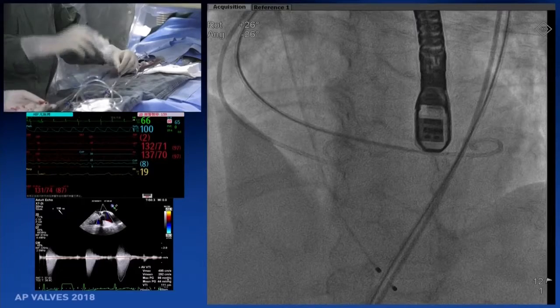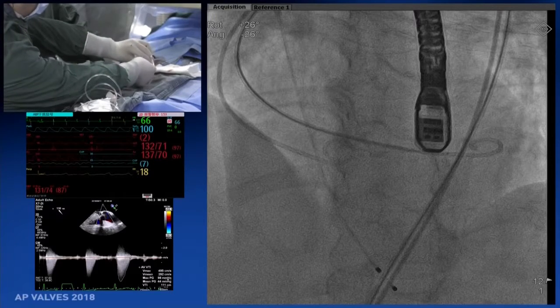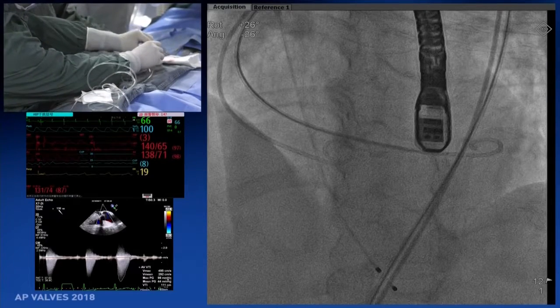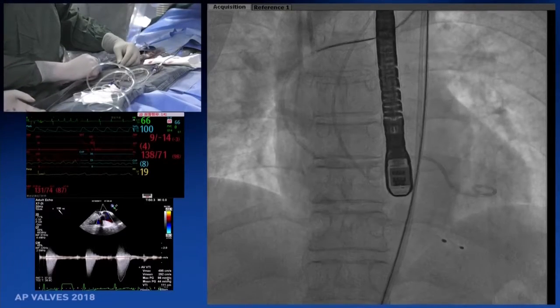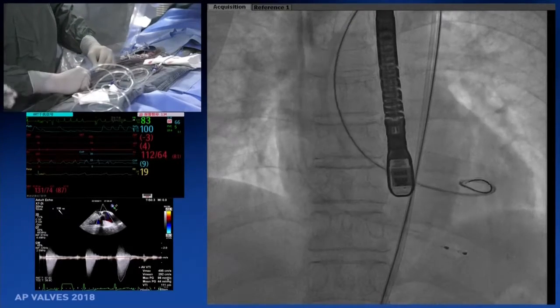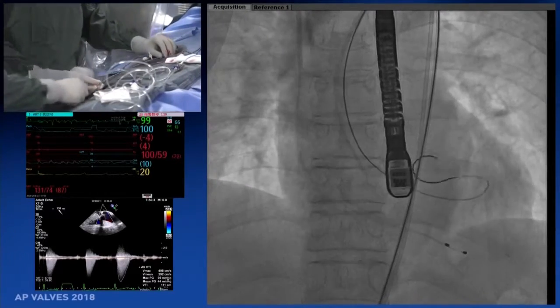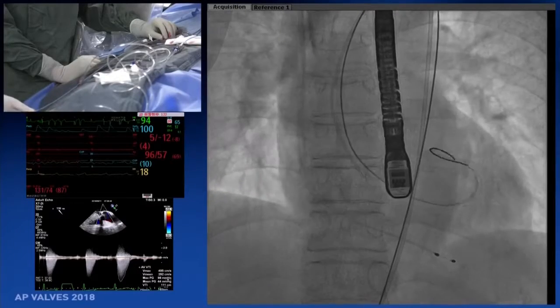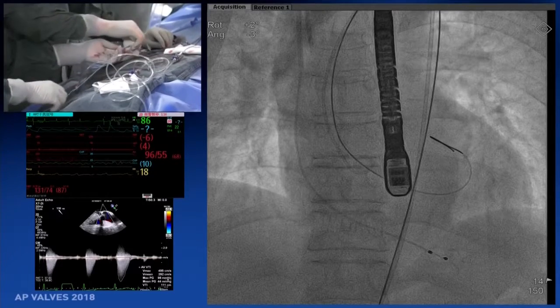Is it the straight Lunderquist or the curved Lunderquist? I don't like the Lunderquist much, but we have only Lunderquist available, so we have to do that. My question is, is it the curved version or the straight version? The aorta is very tortuous. It's a straight version; we make a circle on the tip. You may be aware that there's a curved version for thoracic endografting and a straight version. That curve is not at the tip, it's about where the aortic arch is supposed to be.